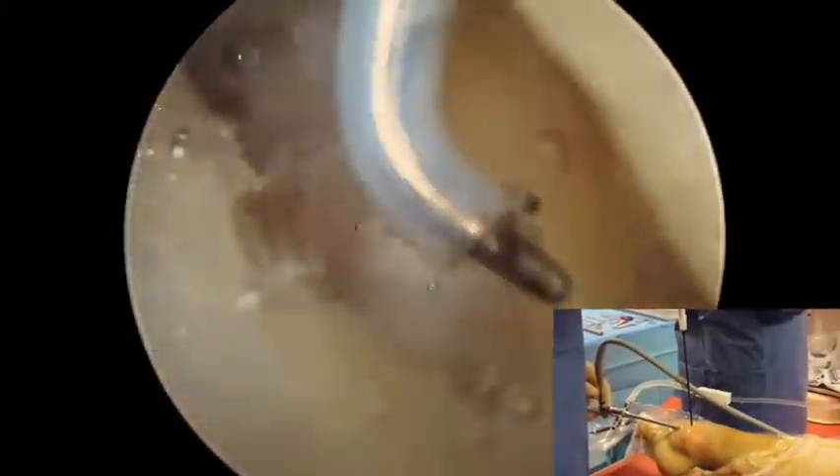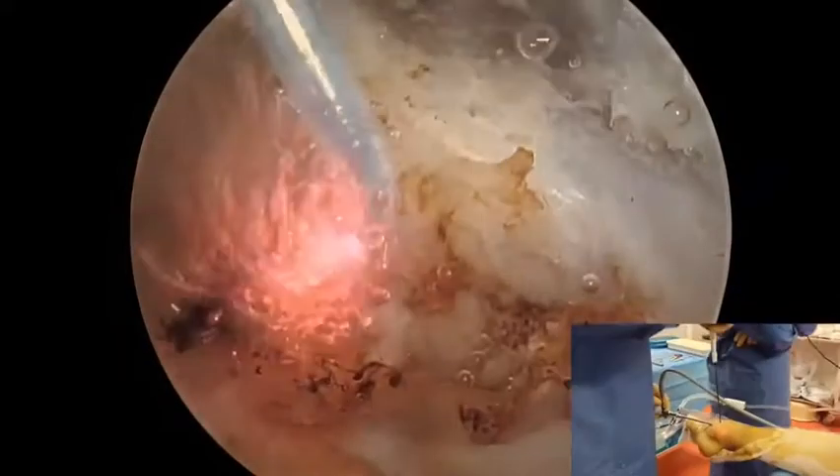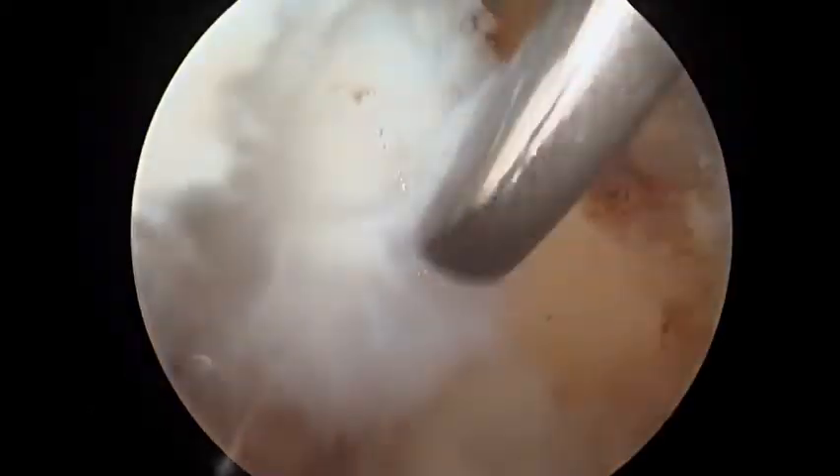The electrocautery is then used through the anterolateral portal to peel off tissue from the ATFL to CFL footprints. After this, the obscure tubercle is visible, marking the transition point between the ATFL and CFL.